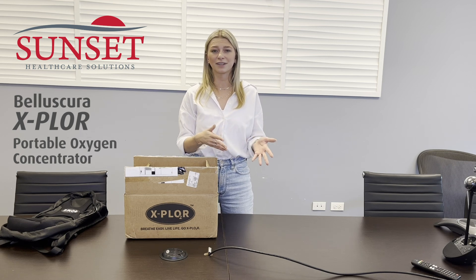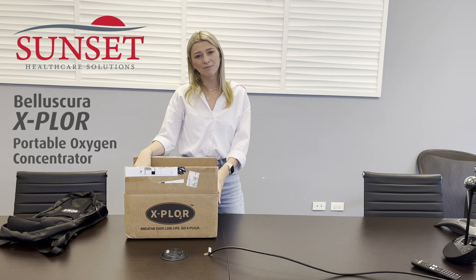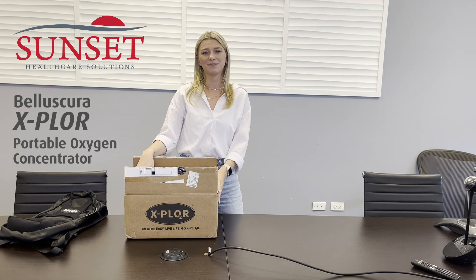We are seeing a lot more DMEs moving to the POC model as opposed to using oxygen tanks. It provides long-term cost savings by removing the need for drivers to fill and service tanks. These also give your patients a lot more mobility and independence.